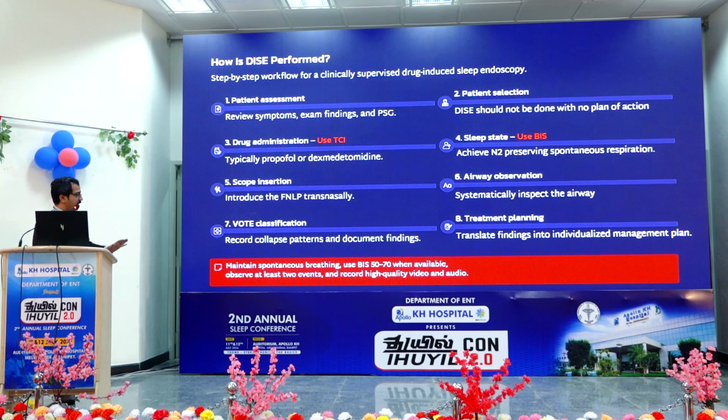One thing to take care of is that the patient should be spontaneously breathing. A recommended BIS spectral value is between 50 to 70. At every station you wait for 2 events to happen and then score, and if possible record a video and audio, so that later it can be used for your documentation and you can discuss with the patient also.